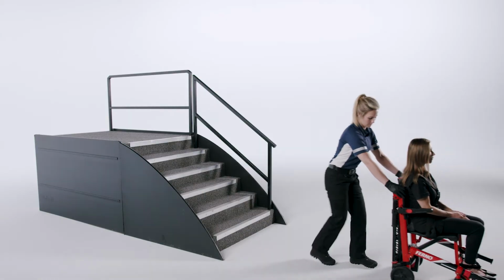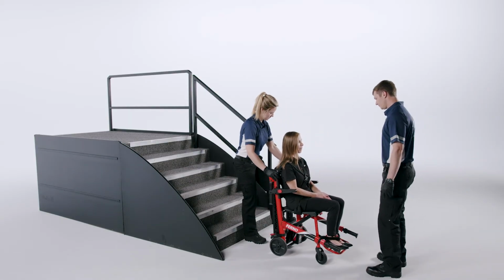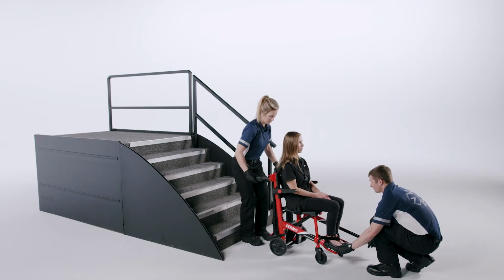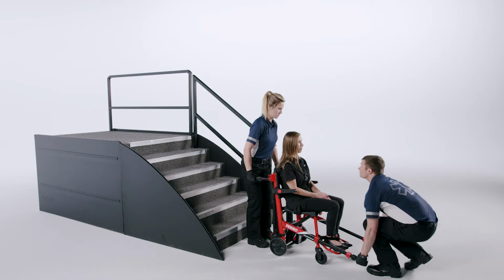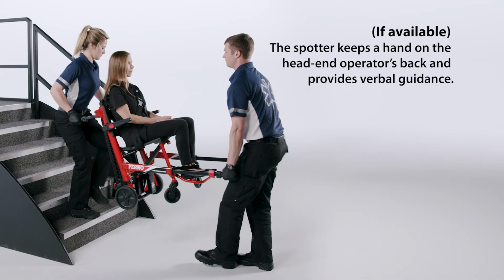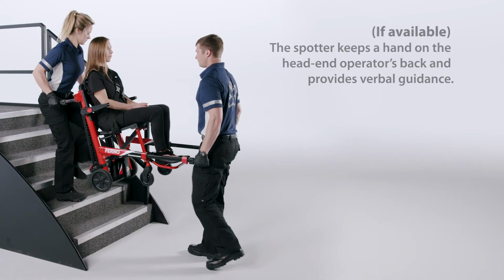Roll the chair to the bottom of the stairs. Raise the extending lift bar or rear lift handles if present. Extend the foot end lift handles. Working together, lift the chair and carry it up the stairs. The spotter, if available, keeps a hand on the head end operator's back and provides verbal guidance.